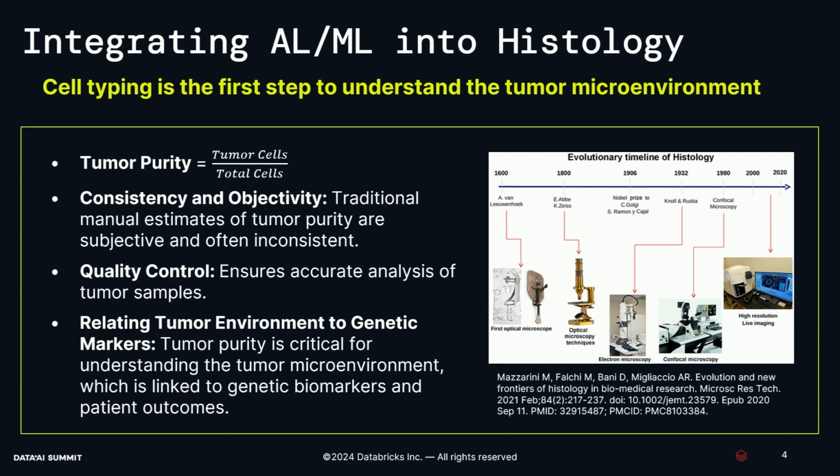So we measured tumor purity in this case, really because we wanted something that would help with our TrueSight oncology genetic sequencing workflow. Tumor purity is just the number of tumor cells over the number of total cells. It helps with consistent objectivity, and it helps with quality control.